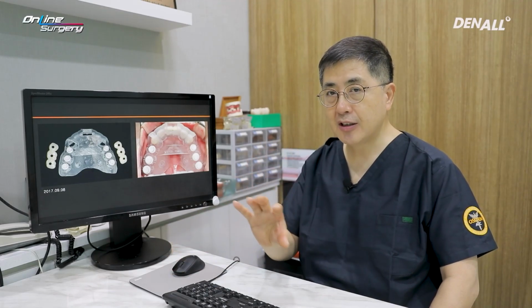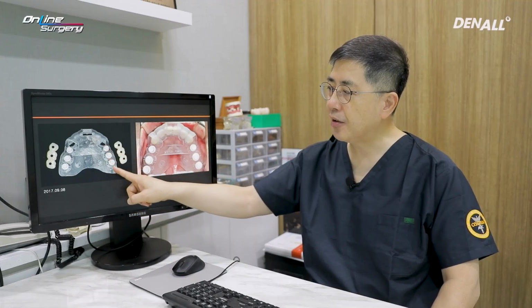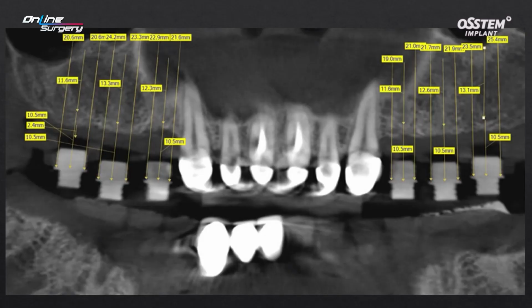I'm a kind of a worried freak, so even if you use guide using various data, there can be slight error. So always after making guide, I use CT checker. I do this before surgery. For surgery of this patient, OneGuide and provisional and abutments were all ready, and right before surgery, CT checker was connected and CT was taken to confirm everything once again. Surgical sites were confirmed and flapless surgery was planned. Accurate evaluation of guide was necessary before surgery.